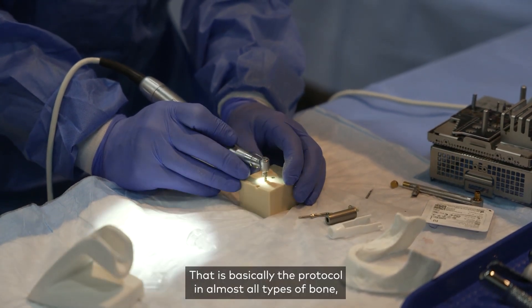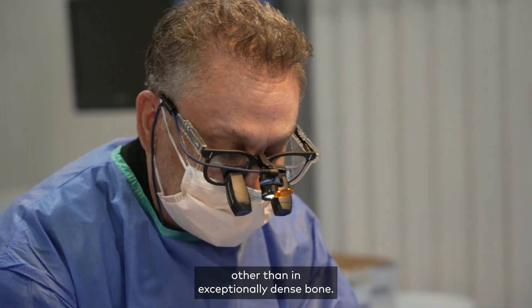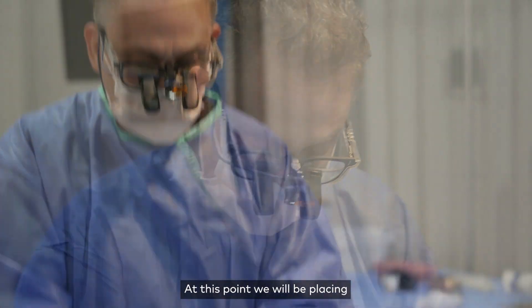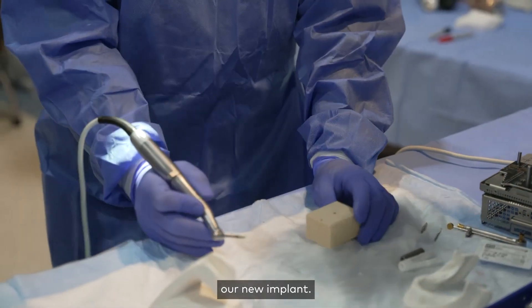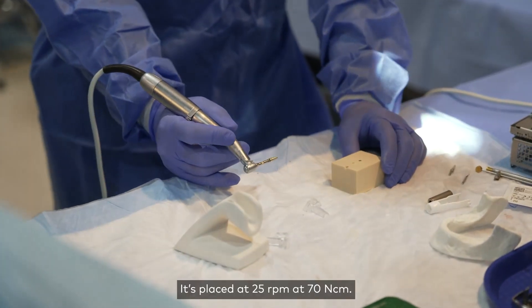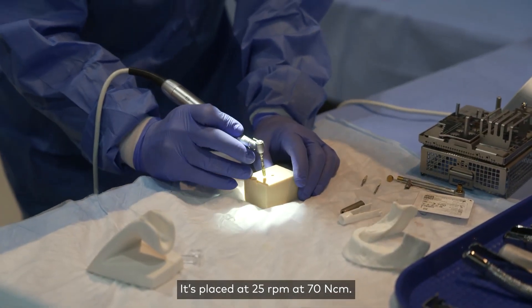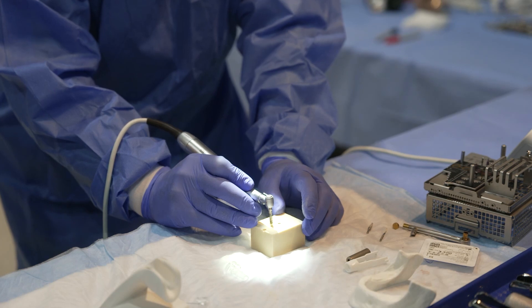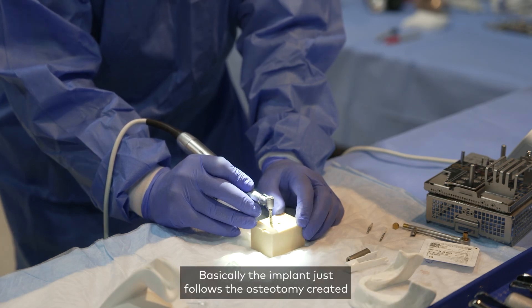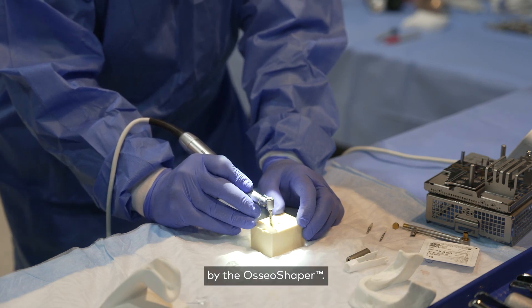That is basically the protocol in almost all types of bone other than exceptionally dense bone. At this point we will be placing our new implant — it's placed at 25 revolutions per minute at 70 Newton centimeters. The implant just follows the osteotomy created by the osseo shaper.